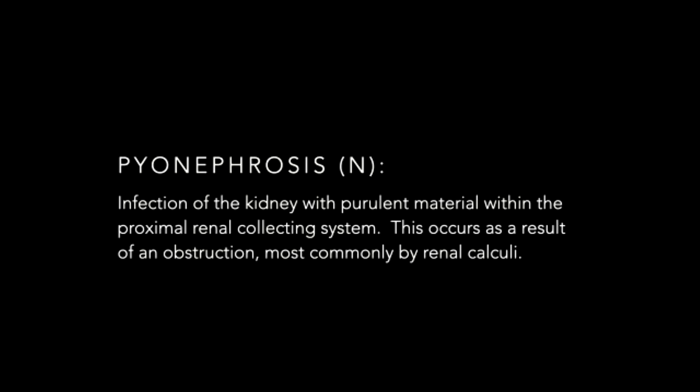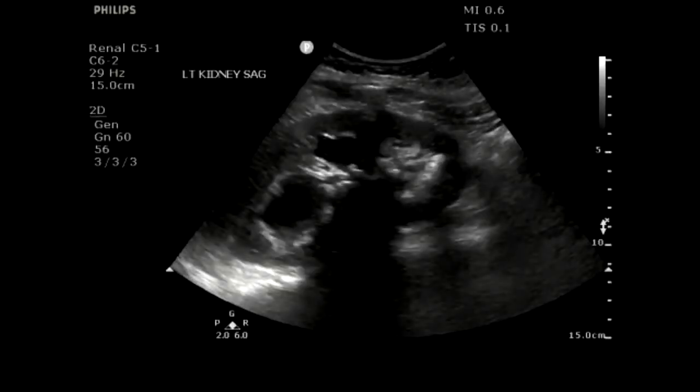Pyonephrosis is basically an infection of the kidney with purulent material within the proximal renal collecting system, occurring generally as a result of obstruction — generally by renal calculi. Untreated, it has high morbidity and mortality, and can lead to fulminant bacteremia, shock, and sepsis in a large number of patients. It's thought to be one of the causes — or at least a need-to-rule-out cause — in patients with urosepsis. It's generally treated by drainage: you get a percutaneous nephrostomy tube to get that pus out, because pus under pressure is a double whammy for badness. Without getting that pus out, the patient's not going to get better despite antibiotics. You have to drain the collecting system, get them on antibiotics, and get the urologist in to help.